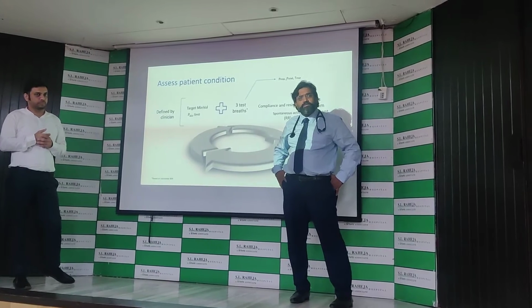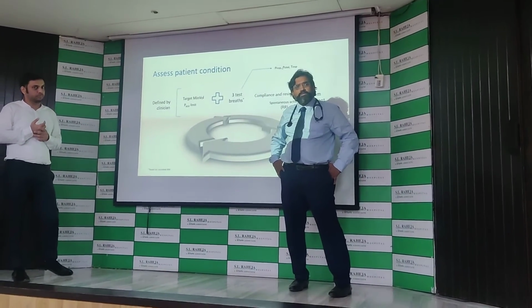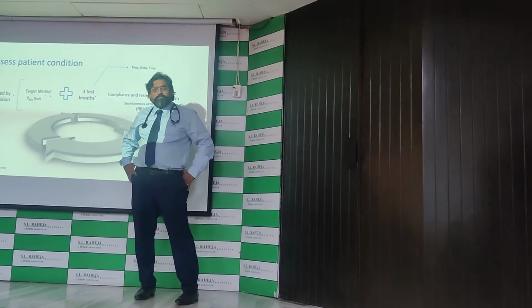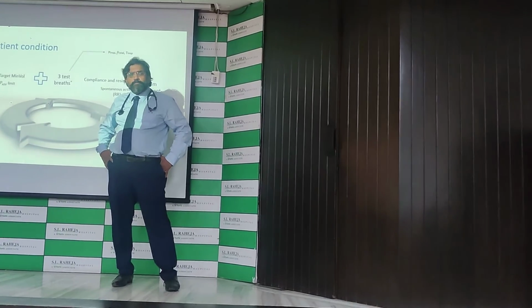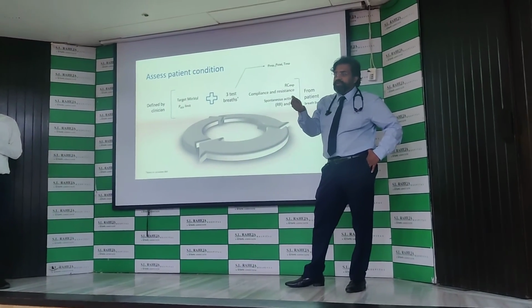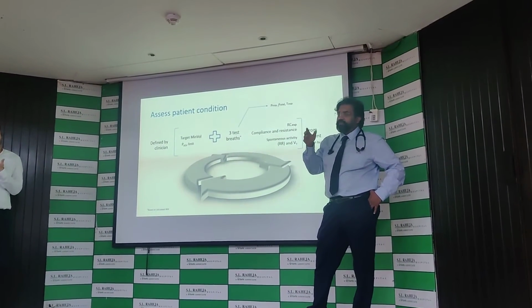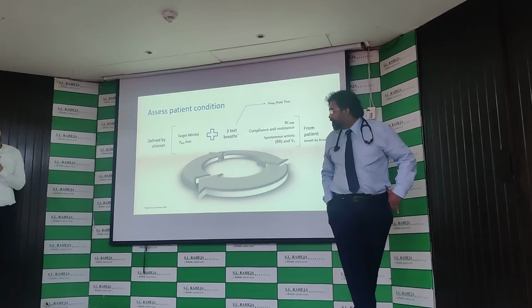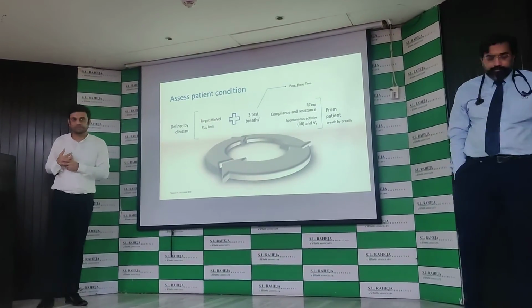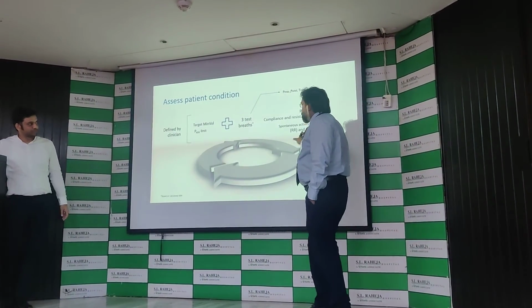Anytime after you change any settings related to target minute ventilation, it will also try to re-verify that the tidal volume and the rates are accordingly matched to the patient's respiratory mechanics. So what we should do, on our existing ventilator, is change the ventilation and see whether it is actually giving those 3 breaths. If it is giving those 3 breaths after every change of minute ventilation, then we know that this is how it's working. So this is knowledge-based communication.